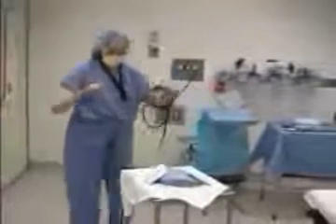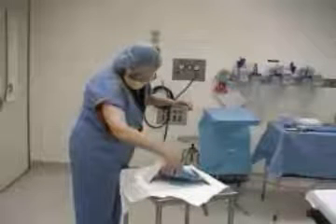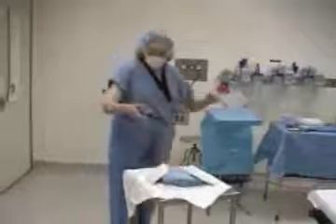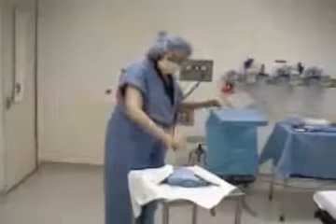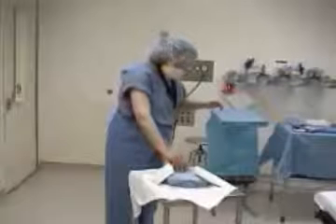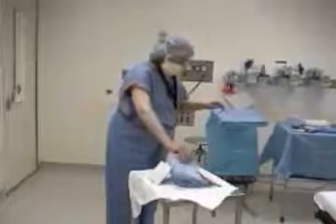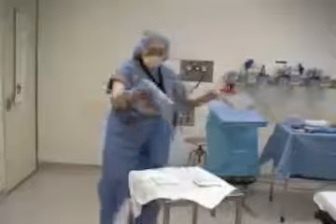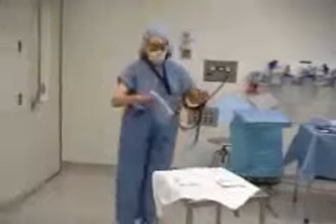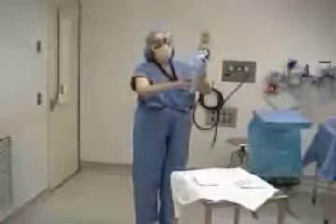The next step is to take a look at your gown and see where it is. Never put your hands underneath because you don't know if that paper's been ripped when you opened it. You didn't see the bottom end of that, and you don't want to find out that your gown is contaminated. If you can't see what you're grabbing, you may end up contaminating your hands and having to repeat your surgical hand scrub all over again. So grab the gown, lift it up and away from your sterile field. Notice that my gloves didn't go too far — they're still in the sterile field.